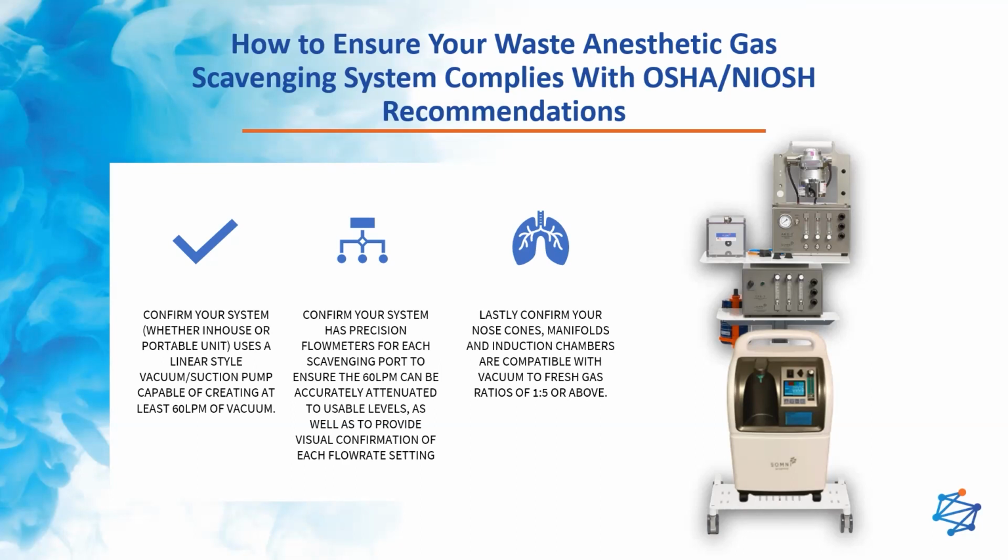It's also beneficial just for areas that might have a higher throughput with the amount of animals that they're working on. Second would be to confirm your system has independent flow meters for each scavenging port so that you can accurately attenuate how much gas is being drawn away.